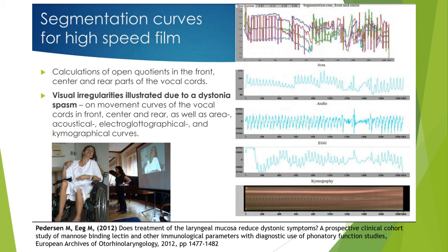If you look at the dystonic patient's electroglottographic curve, it is visually clear that it is abnormal. We have also made pictures after treatment and can see that the electroglottography becomes more normal. Electroglottography is very interesting, and there is much more work to do to differentiate the various forms of curves.